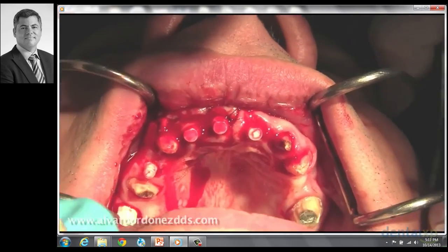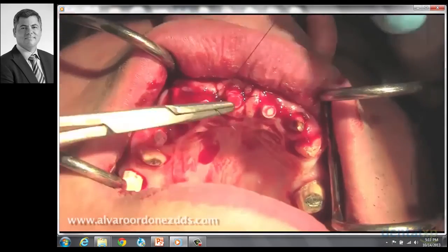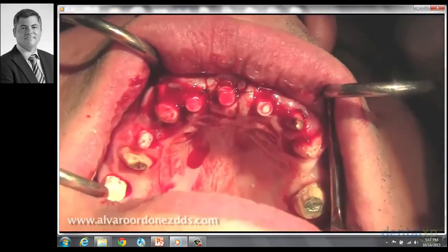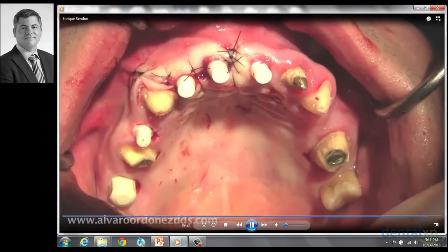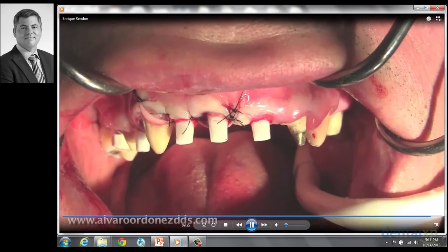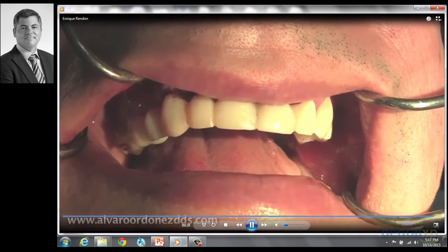It can sometimes pinch the soft tissues of the patient. If patients complain or if you see anything, you can take a hot instrument and heat the tip of the area where you did the cut of the suture, and it will be dull and it will not bother the patient anymore.